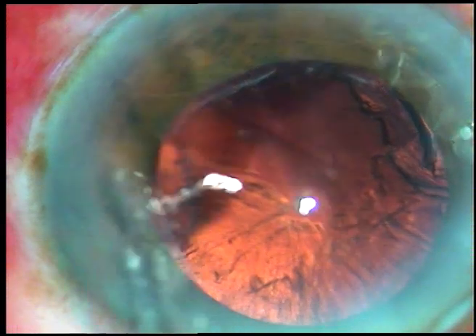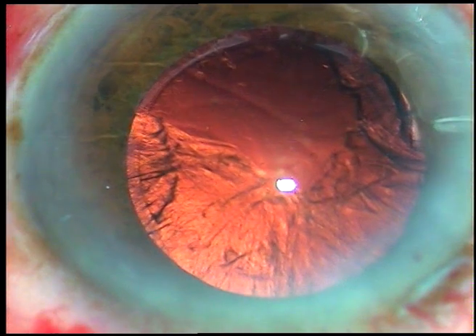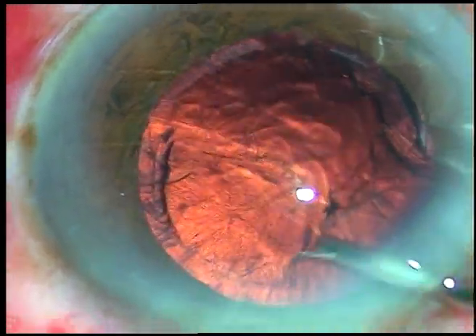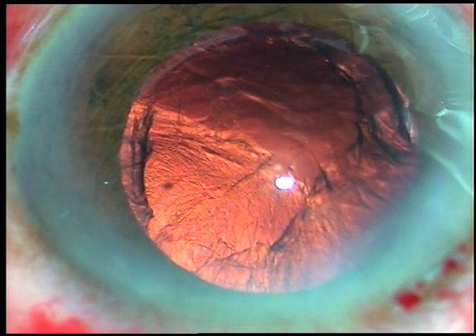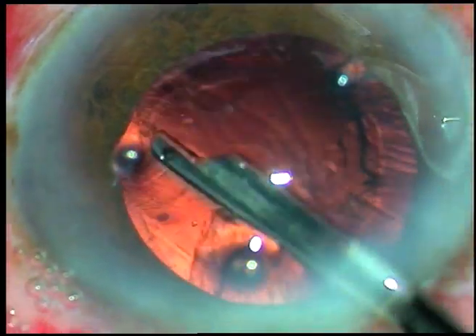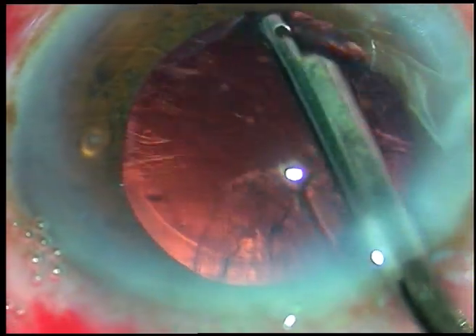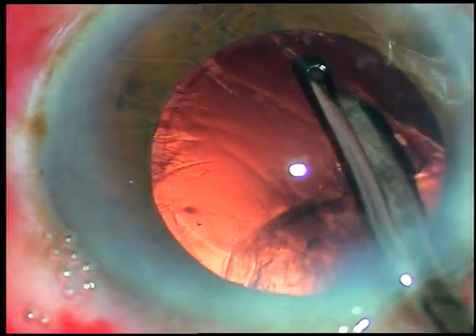And now the cortical matter is to be removed. Some viscoelastic substance is injected. And now a 23-gauge Simcoe cannula is being used to remove the cortical matter. This instrument works like a magic wand in my hands.